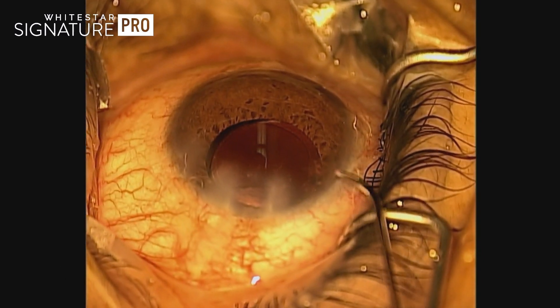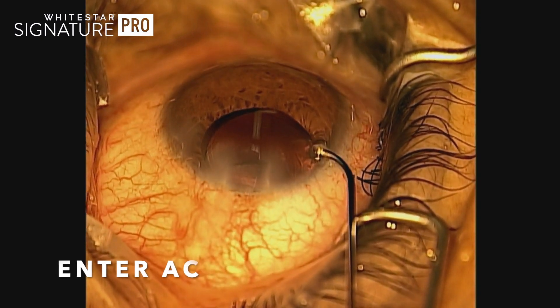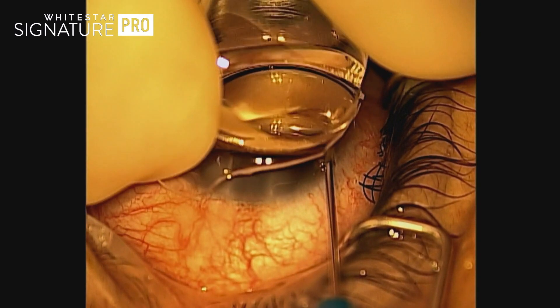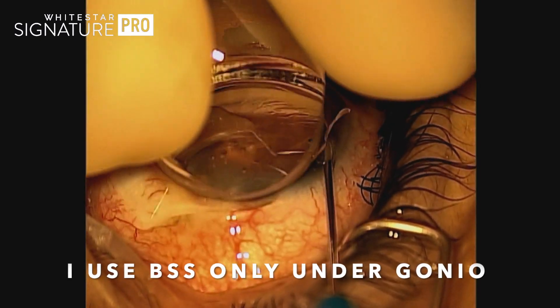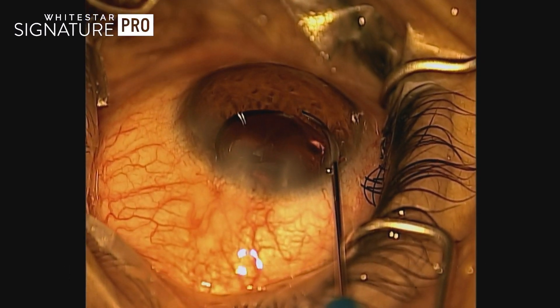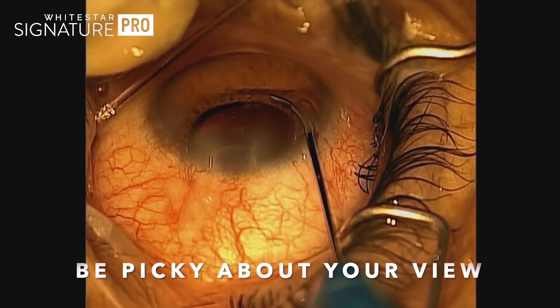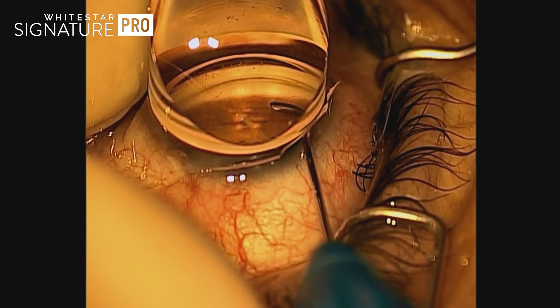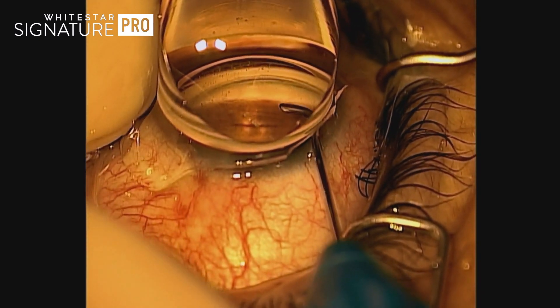Checking the Hydrus, making sure it's all right. Once you go into the anterior chamber and obtain the view you want, just put a little BSS. I found that Healon or viscoelastic on the cornea just slides around the gonioprism too much, so a little BSS for me is fine.